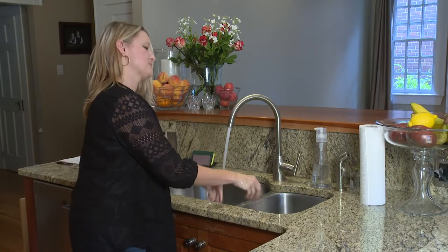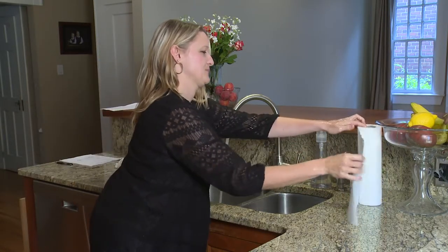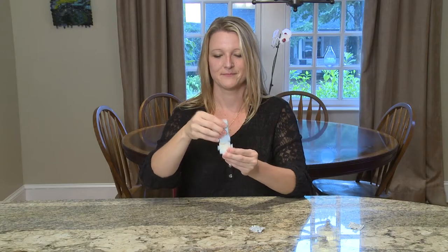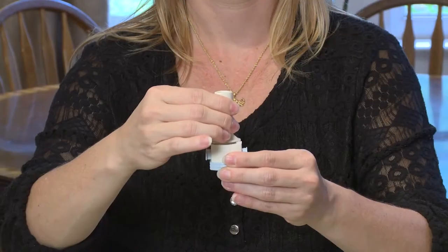It is important to wash your hands with warm soapy water and then dry them completely before using your neohaler. Open the neohaler by removing the cap, then flip open the mouthpiece.